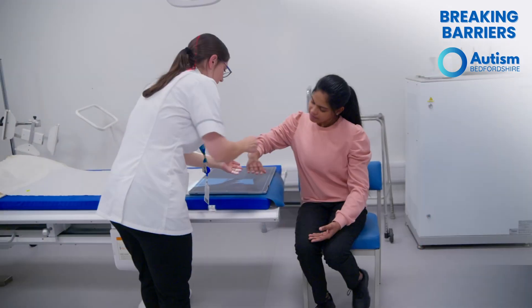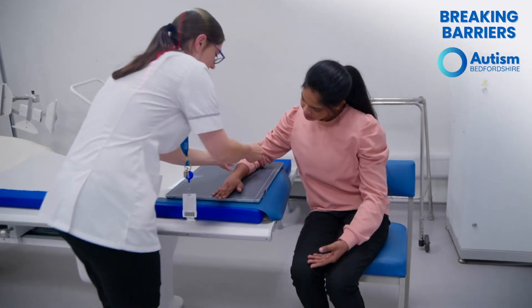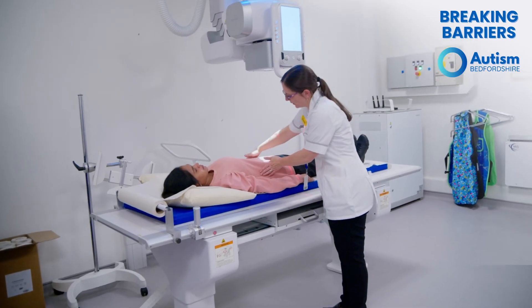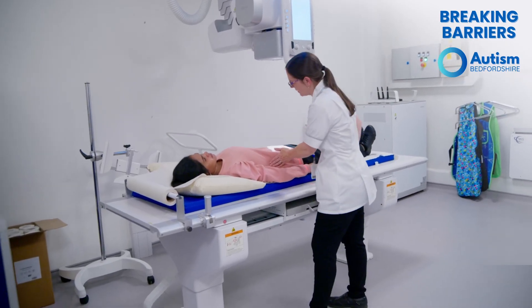There are many different ways to have an x-ray, and the radiographer will explain how they need you to be positioned. You can ask them questions at any time. The radiographer may need to feel your body to get you in the right position, and they will always be as gentle as possible.